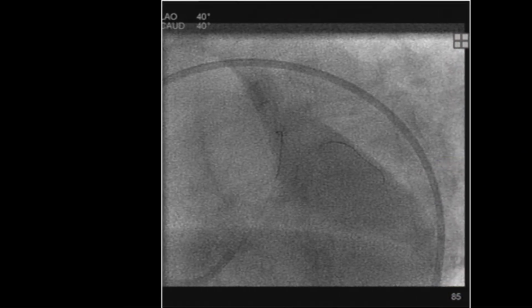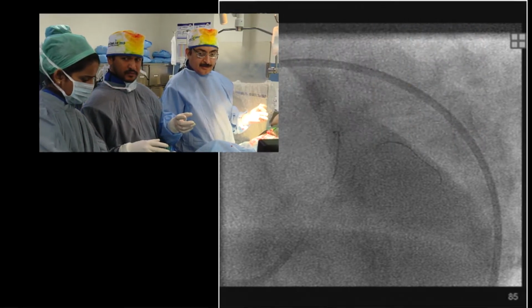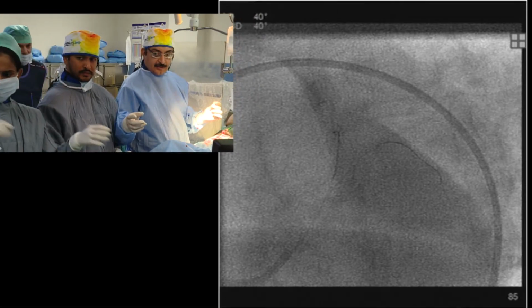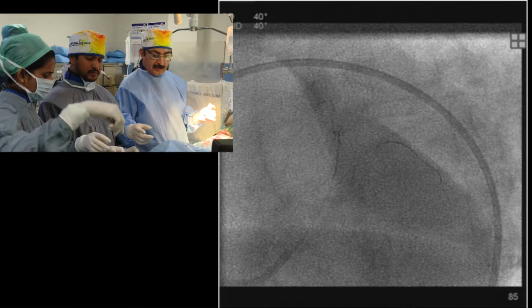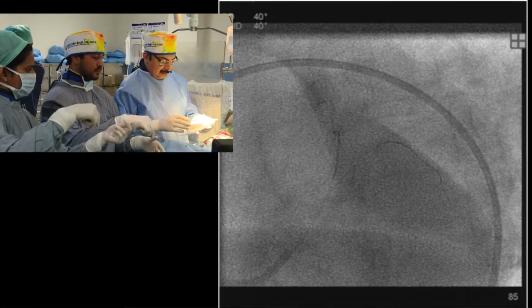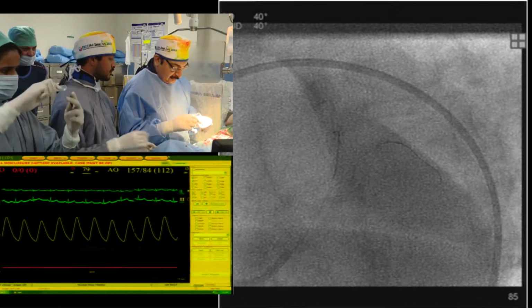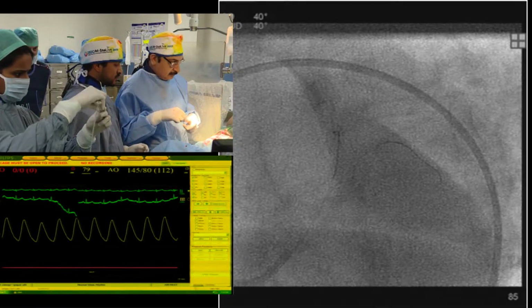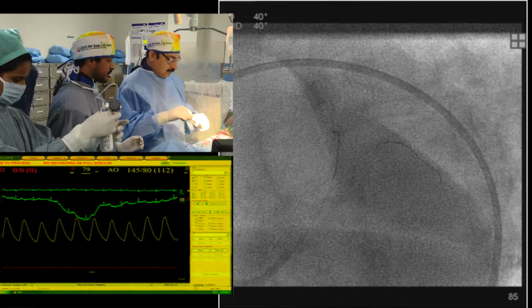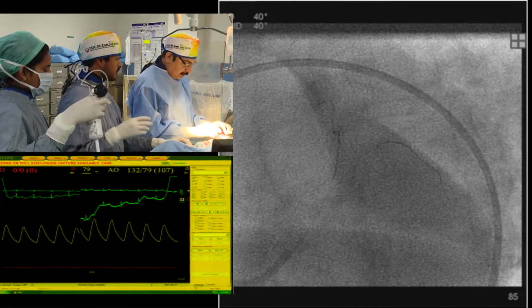And we unfortunately had a loss of time for the transmission, so we have about 5 minutes. Please take your time, but it's just for your information. Okay. So we have dilated with a 2 millimeter balloon, and now we have taken a 2.25 millimeter cutting balloon. Okay, hold. Holding.